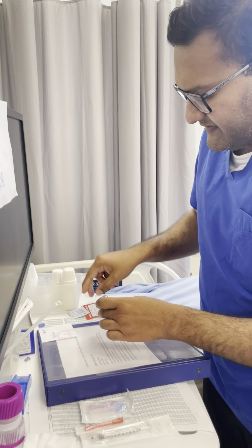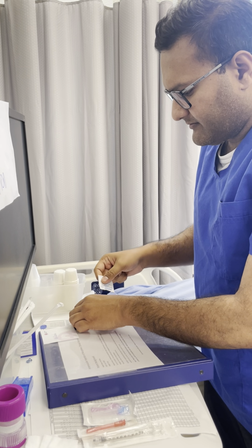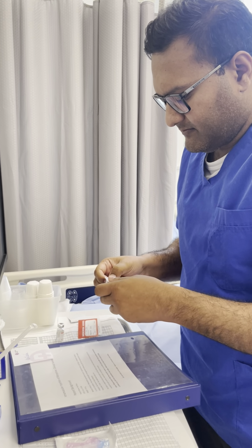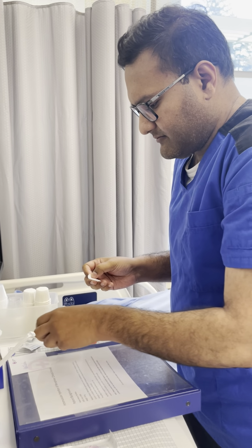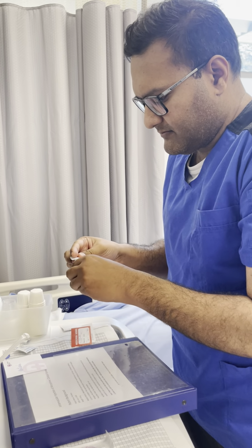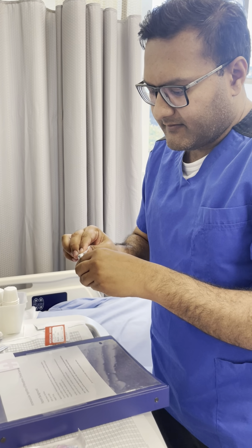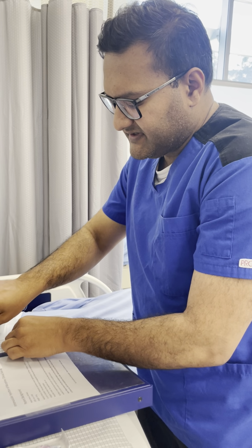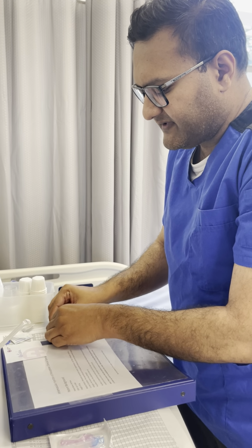I'm going to open up the vial. I'm going to clean the vial for 15 seconds. After the 15 seconds, I will wait for this vial to dry.